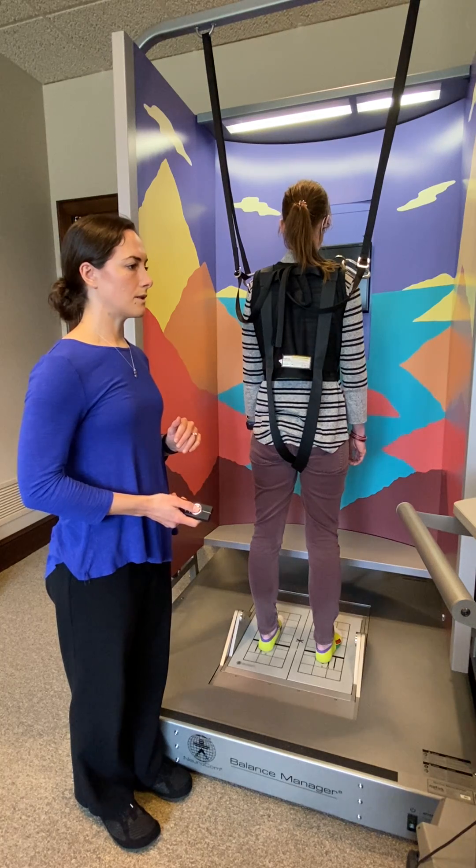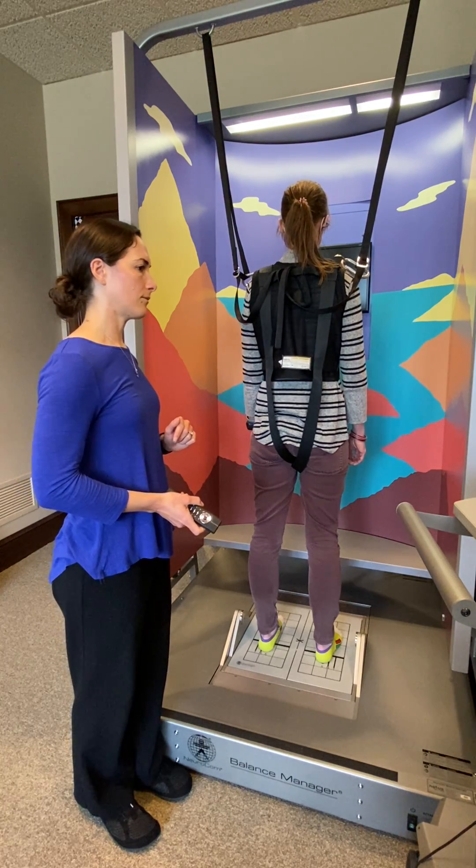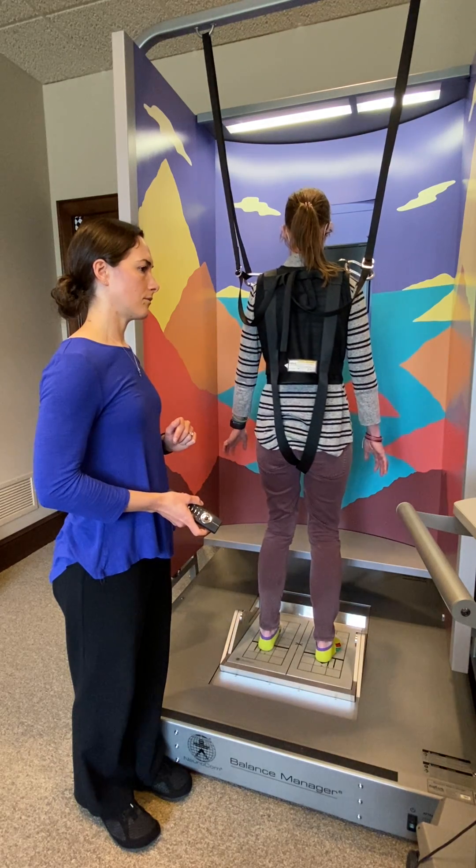Okay, toes-down. Are you ready? Ready. I'll begin the test starting now. Okay, nice job.